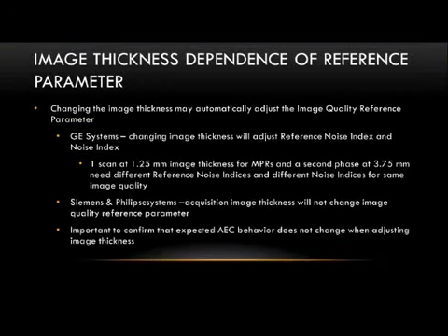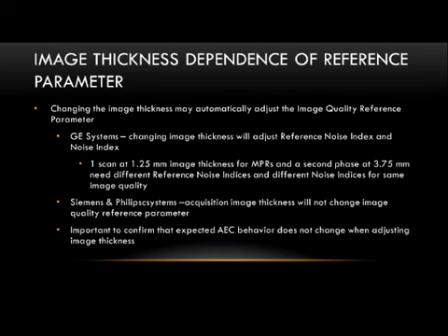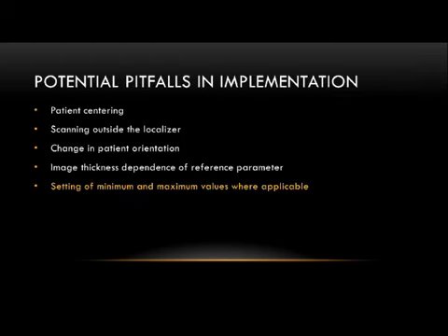But luckily, at lunch and breakfast tomorrow morning, you're going to be able to sit with representatives from each of the vendors. And this is a question you can ask them. And I bet you they're all going to make sure they have the answers from home base tonight for this, to know what happens if you change the acquisition image thickness. So they'll be prepared, I'm sure, so you can ask them. So it's really important to keep that in mind, and that one little change, like, I don't need these thin because I'm not going to use them, can have a significant impact on how the images are acquired.